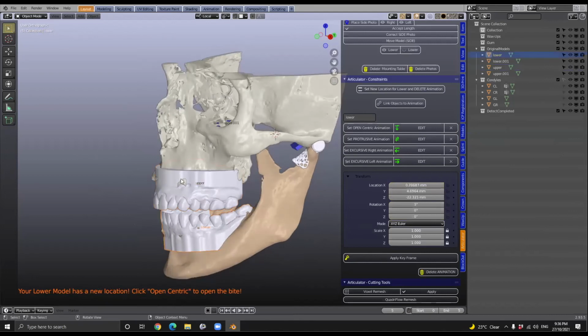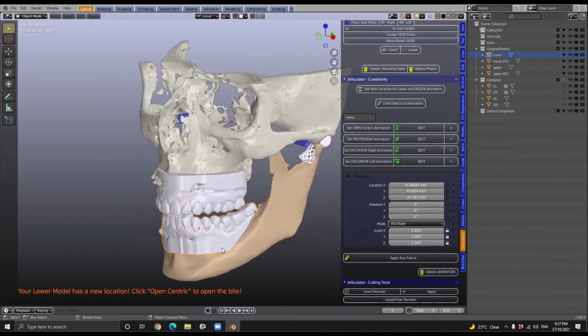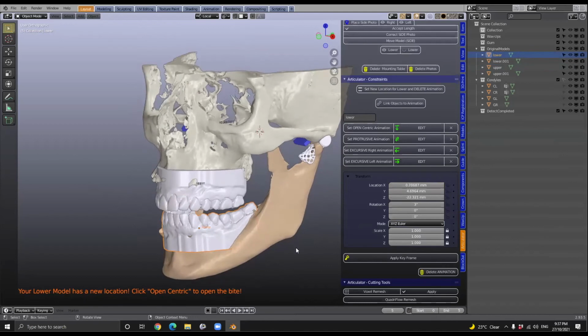This has been opened up almost like you've opened it up outside of the digital. It may not be 100%, you've raised the articulator pin, for example. That's correct.